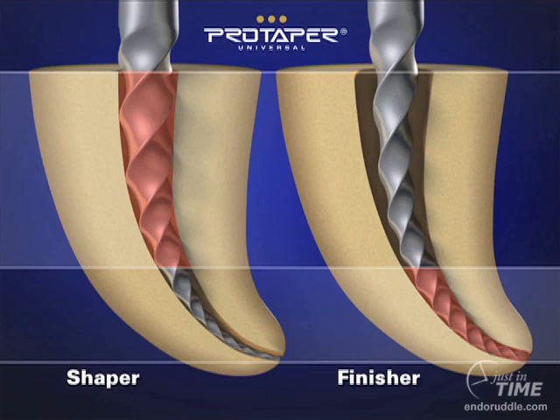By decreasing the percentage taper, we have two significant advantages. Number one, the instrument's more flexible. This helps us go through multiplanar curvature. The other, perhaps more important idea, because most curvatures are in the apical third, but the second most important thing, is probably that the finishers do not continue to enlarge the canal in the coronal two thirds. This means we maximize remaining dentin. This means we do not overexpand preparations where we can thin roots out and predispose to longitudinal fractures, or worse yet, strip perforate the root, and that would create another whole series of problems to overcome.